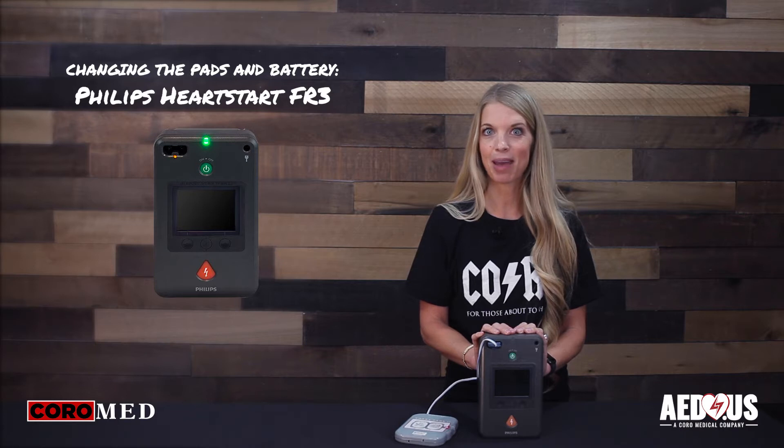This is Blair with Cora Medical, home of AED.us, and today we're going to go over how to change the pads and batteries in the Philips FR3 AED.